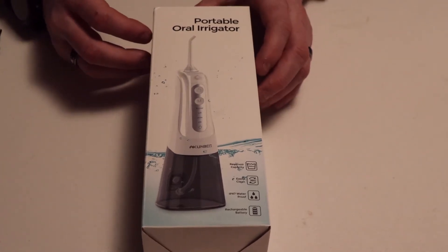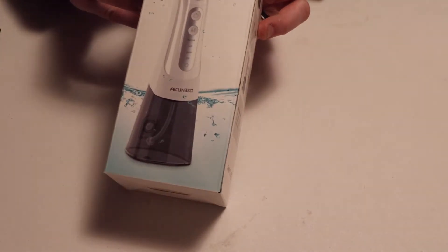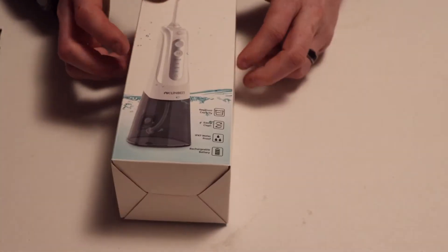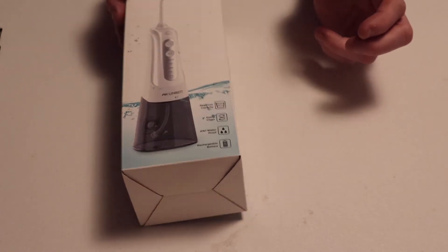Today we're going to be unboxing the Portable Oral Irrigator, brand name is Ocum BEM. It has a 300 milliliter reservoir capacity, says it's easy to clean, IPX7 waterproof, and it has a rechargeable battery.